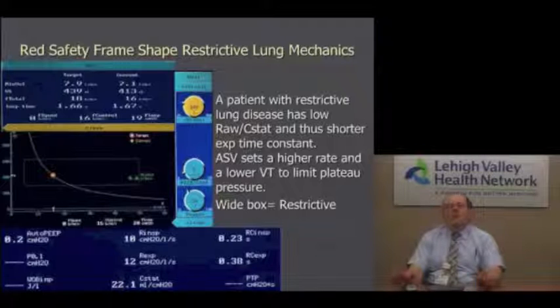This mode is extremely good to use in postoperative patients, in overdose patients, patients that have inconsistent respiratory drive. You could use it with any patient population, but to be honest with you, in the U.S., it's not really caught on to be considered a full ventilatory mode. So we use it as a transitional mode from full ventilatory support to partial to spontaneous breathing.